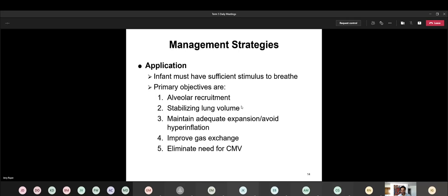So here we go with the baby has to be able to breathe again. I can't stress that enough. If they're having periods of apnea, don't even think about setting up CPAP. Or if the physician isn't aware that baby's having a lot of periods of apnea or lots of A's and B's, then again, just tell the physician that this is not going to work out. Baby's still having way too much apnea.